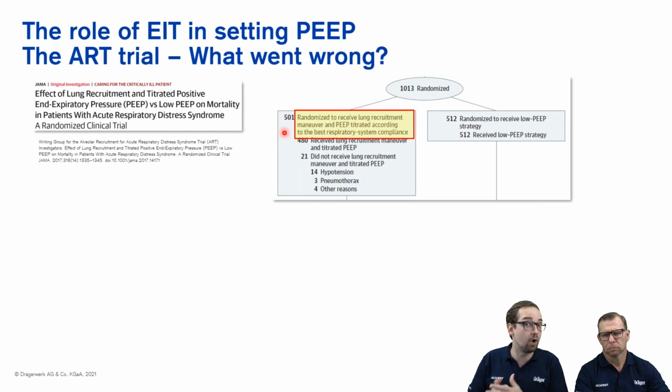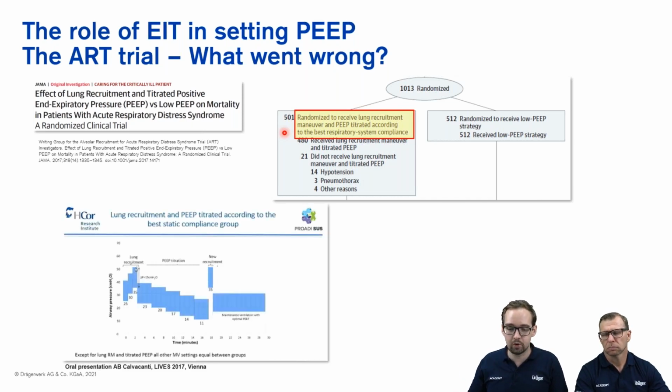Is this beneficial for all patients? And of course, lung recruitment is only the first step. So really then also looking at what's next, which PEEP should I set? In this study, they had a protocol which looked very similar to this.